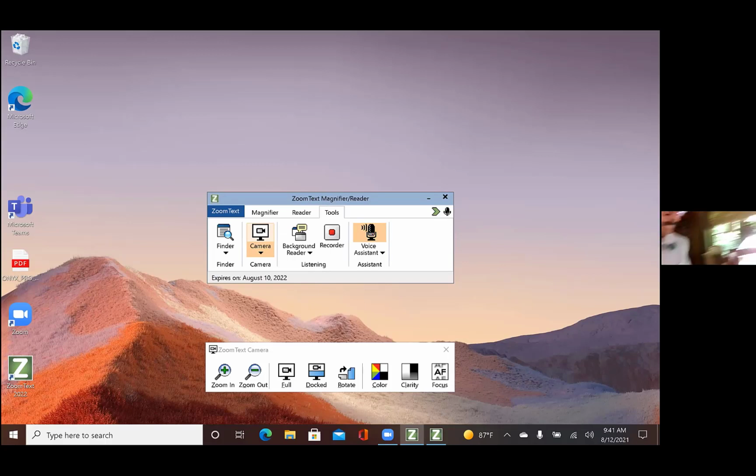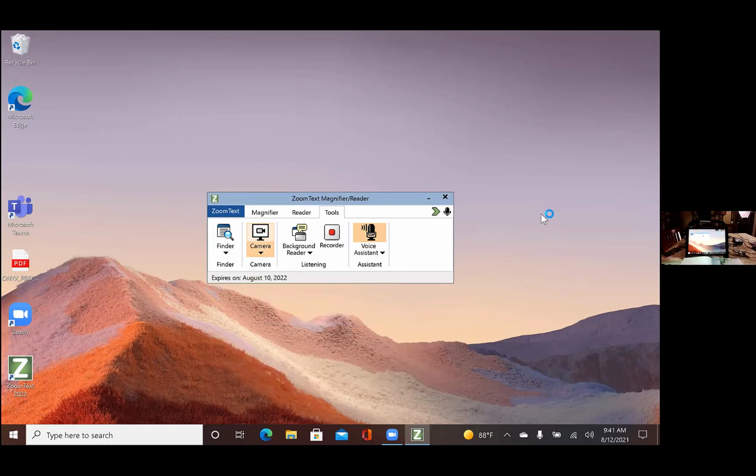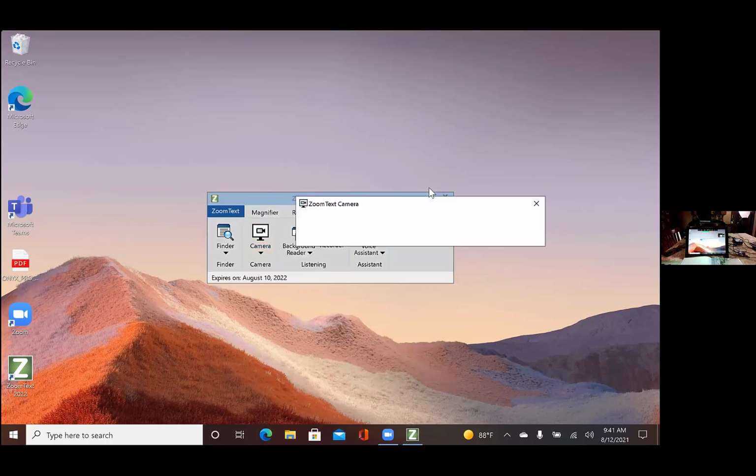Yeah, so when you're in that dock view, to Mike's point, you may have the camera in a distance mode, perhaps looking at notes on a whiteboard, taking notes on a Word document within the Zoom text environment using that dock mode or split mode. But if you wanted to use it as a dedicated video magnifier, in that Zoom text UI you can go to full. I think it's called full, right? So if I change from camera to full view? Full view, yeah. So then full view essentially puts you back into the app environment that Mike was demonstrating earlier.